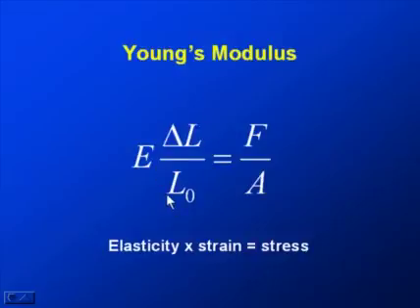Strain does not have a direct physical equivalency, but if you want to contrast it to ultrasound imaging, it's sort of the elasticity equivalent of echogenicity. It's not very well defined, but we know what it is.